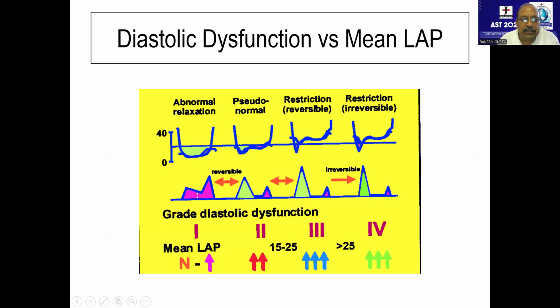If this pattern changes, this is known as grade 1 diastolic dysfunction. If this pattern does not change and you look at a deceleration time of less than 130 milliseconds, we used to call them grade 3 diastolic dysfunction. But with this kind of a pattern, there were many other things. We had to look at the E to A wave ratio, and A wave versus pulmonary venous flow patterns.